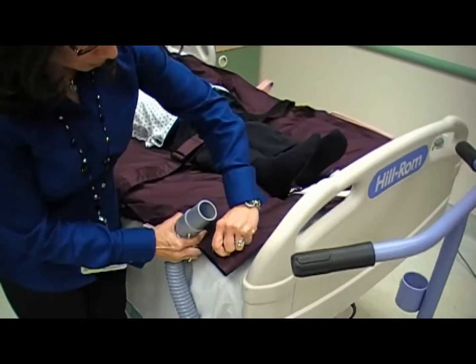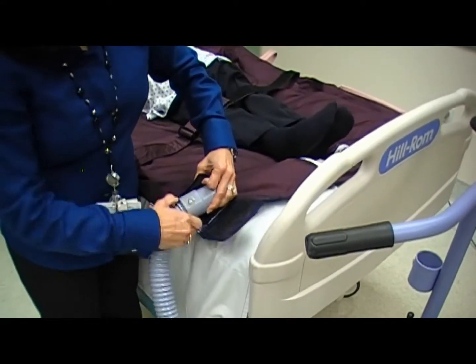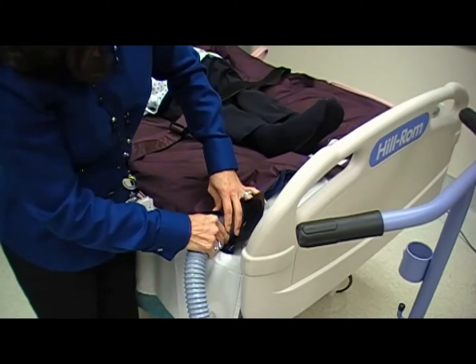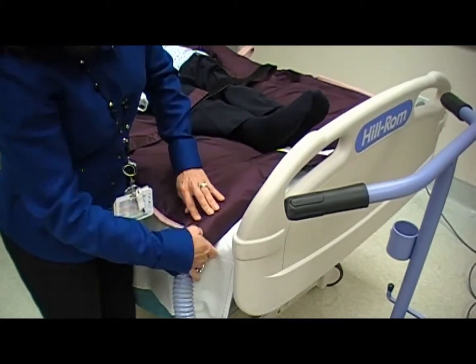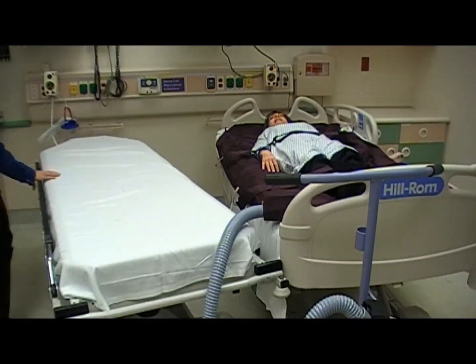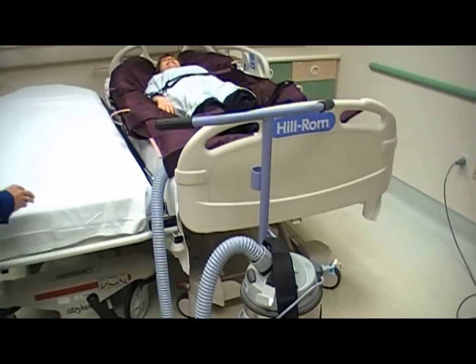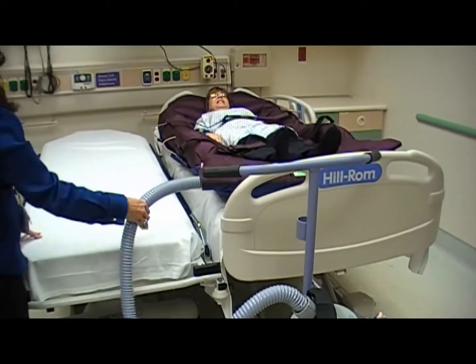Attach the flexible hose to the opening in the corner of the mat and snap into place. Raise the bed so it is slightly higher than the gurney, letting gravity assist in the transfer from higher to lower surface. Set the brake on the bed and gurney. Plug in the air supply, then turn on while monitoring the patient.